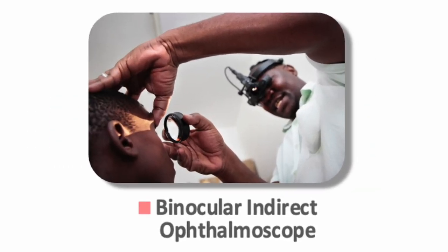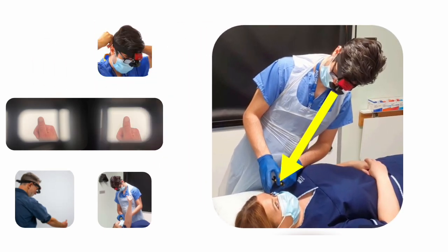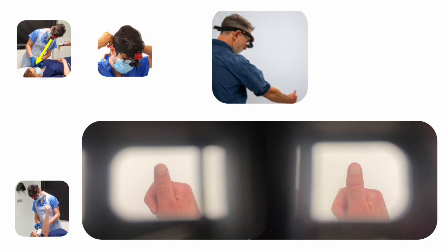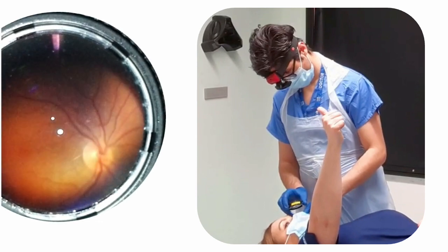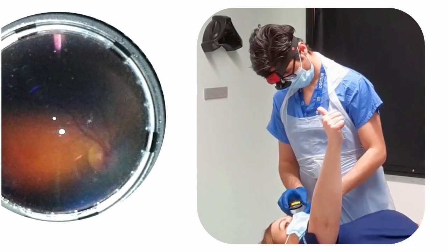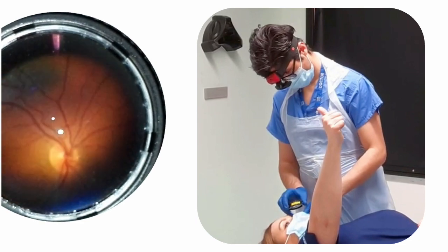Using a binocular indirect ophthalmoscope to examine the macula, patients are best examined lying down, but sitting is okay. Make sure the indirect feels comfortable and it is aligned with your eyes so you can see your thumb in the centre of each eyepiece. Use your fingers to brace the lens at the correct distance and hold the upper lid. By asking the patient to look at their thumb and then move the position of their thumb, you can move their gaze to allow examination of all parts of the fundus. Tilting the lens and varying the brightness of light can improve the view.